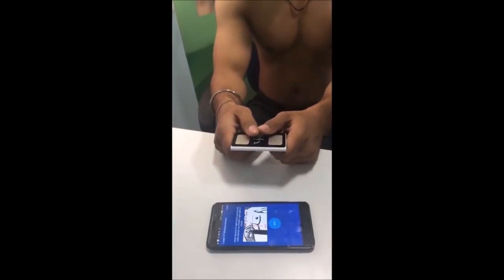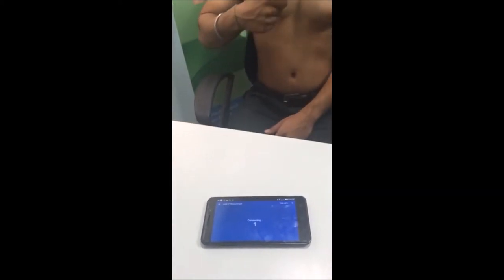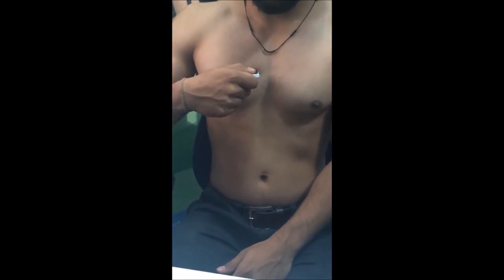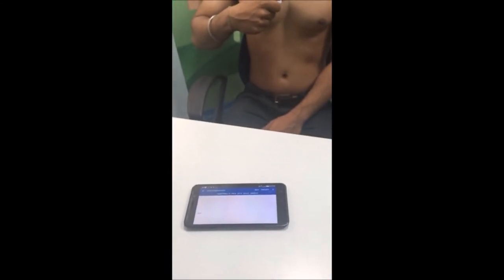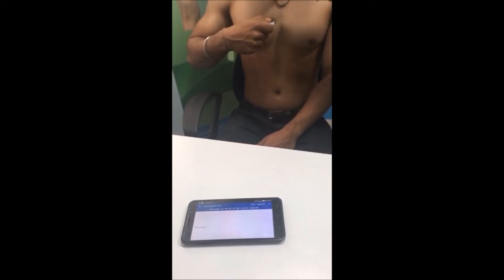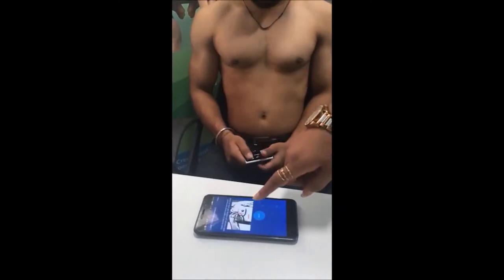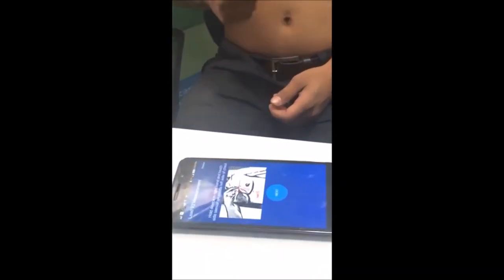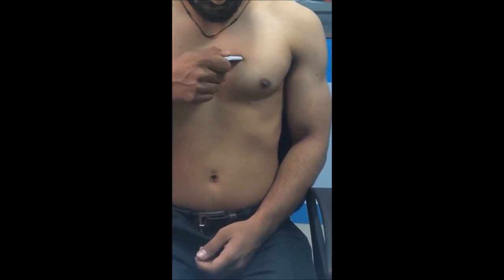Now, to proceed for full 12 lead, next. This is the position for V1. As you can see, his one thumb is on the front sensor, the side sensor is touching his chest. Now, you can see it is asking for V2 measurement. So, the position for V2 is this. He'll hold this device for 15 seconds for V2.